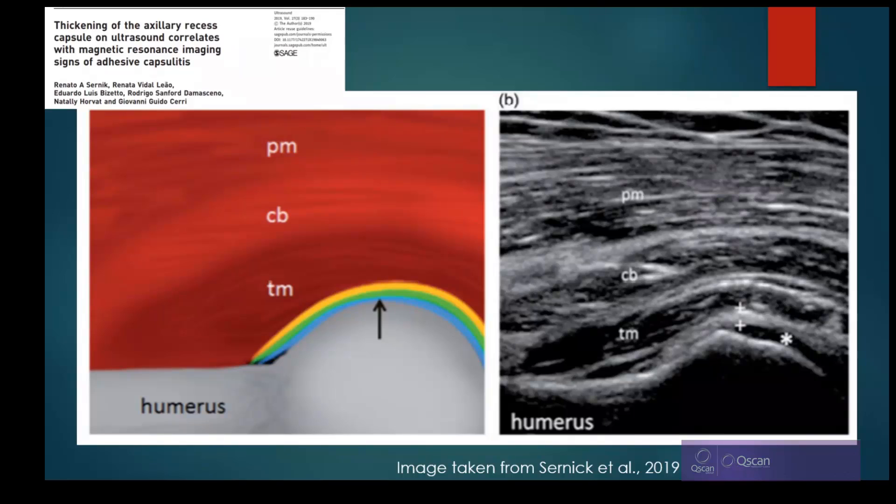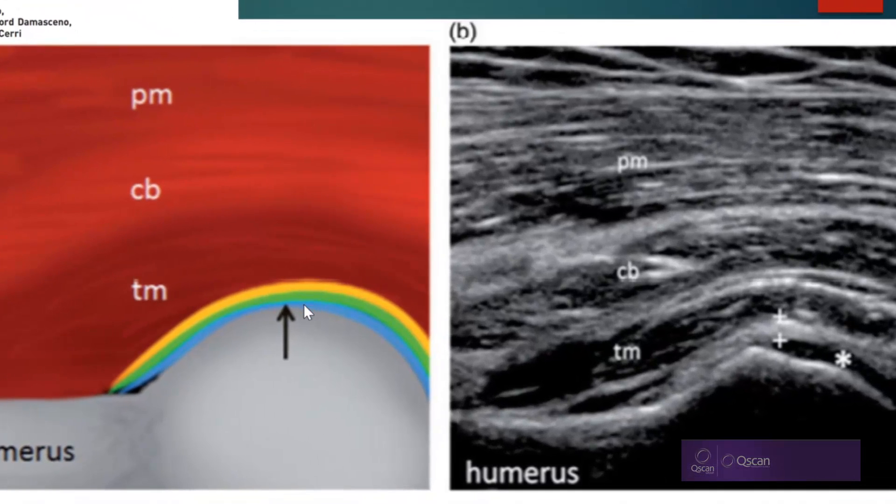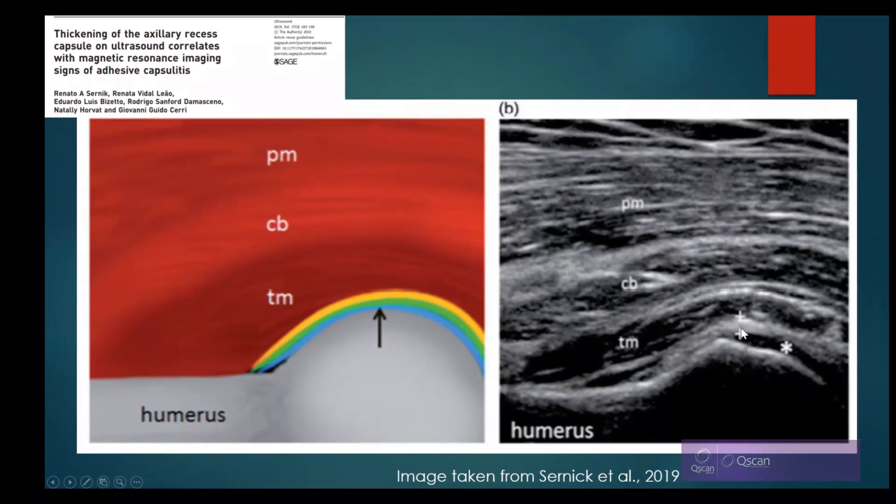The axillary recess anatomy shows the synovium in blue and the hyaline cartilage overlying it, representing the hypoechoic region where the asterisk is. The green represents the inferior glenohumeral ligament. Between the calipers on the ultrasound image, that's what we're measuring for adhesive capsulitis. The joint capsule, shown in yellow, and the ligament together form a complex — essentially we're measuring the two together. Cernic established a two-millimetre cutoff as the upper limit of normal, finding that patients with adhesive capsulitis had a thickness greater than two millimetres.